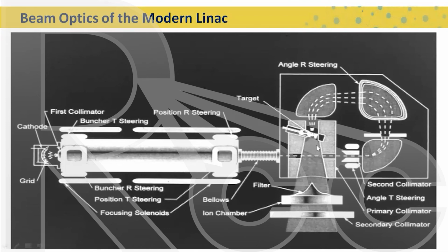Because if you're going to deliver intensity modulated radiotherapy, you deliver it with very small fields anyway from many different angles. Why do you need a flattening filter? Take the flattening filter out, treat with a bullet shape of radiation, and without the flattening filter, you double the dose rate. Without the flattening filter, you get 2,000 centigray per minute. It's a crazy amount of energy in a short burst of radiation.